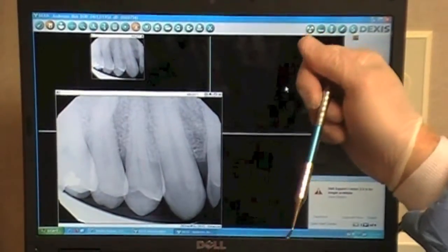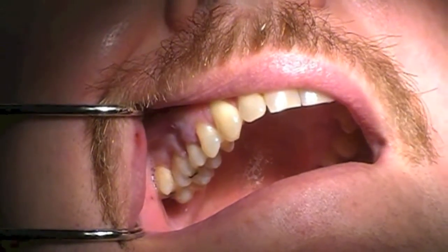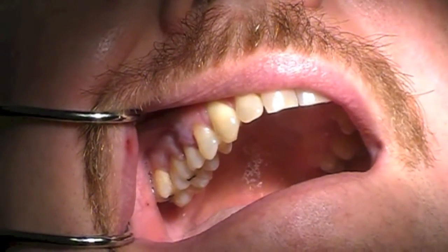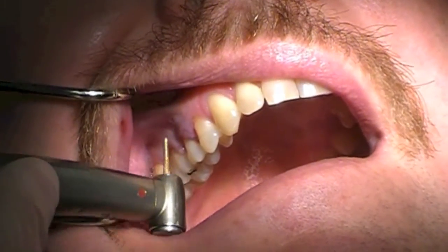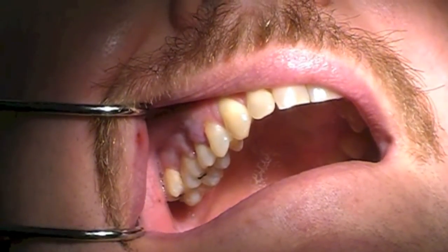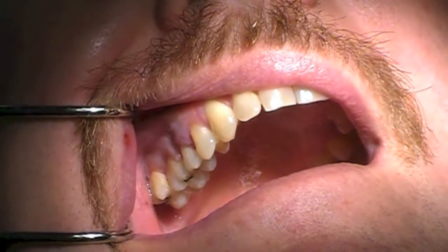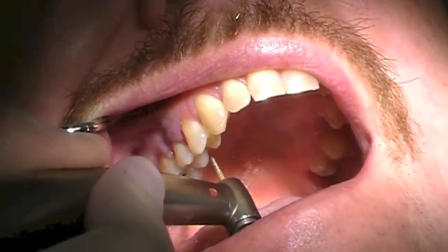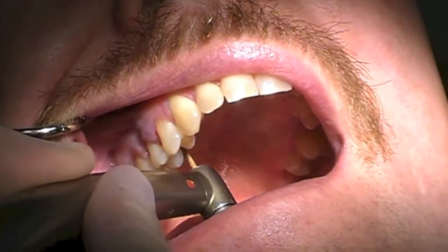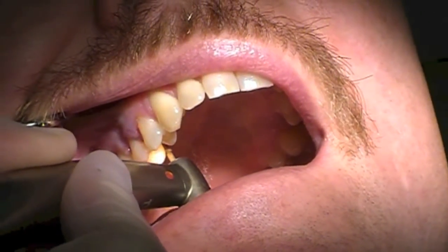Of placing an immediate implant today? The maxillary right second bicuspid has significant inflammation. So prior to extraction, I'm going to flatten out the palatal root structure a little bit. I'm just using a high speed. Open big for me, sir. And I'm going to just flatten the root structure about 5-6 millimeters on the palatal.